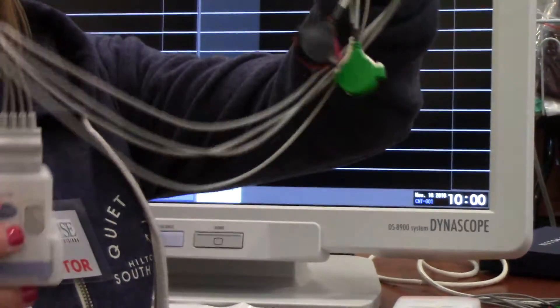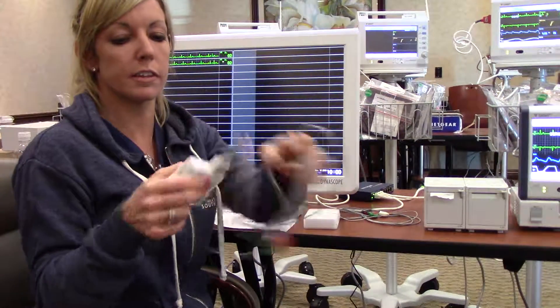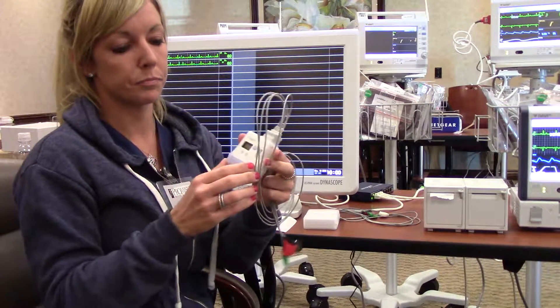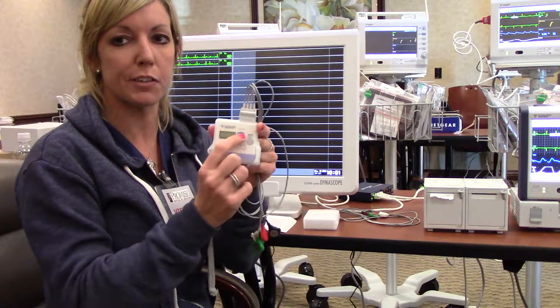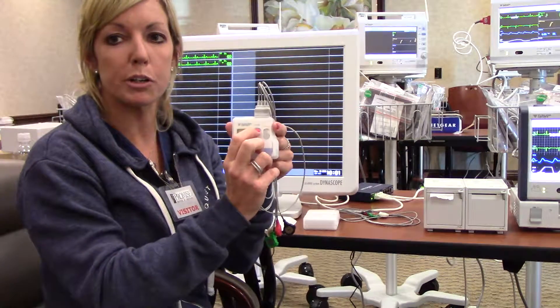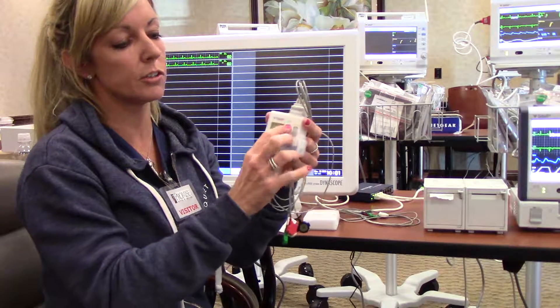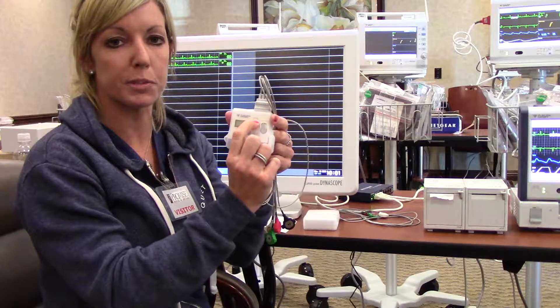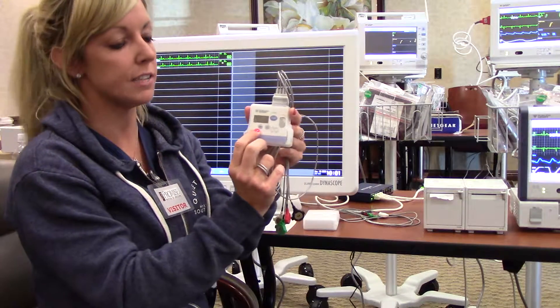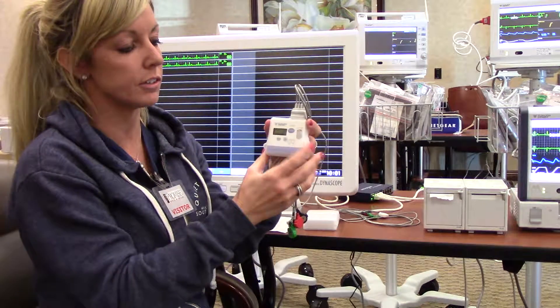It requires a four-lead EKG cable set that is snapped in the top of the unit. There is a blue event key on the front of the monitor. Anytime you want to record a 12-second strip to print at your central monitor, you can hold down the event key for three seconds. Your screen will turn dark and say 'event,' and it will automatically generate a strip at your central monitoring device.